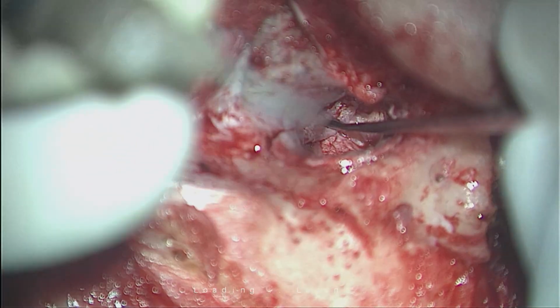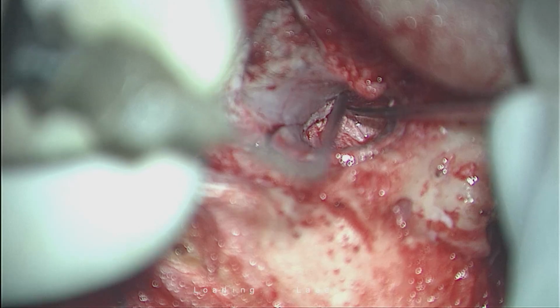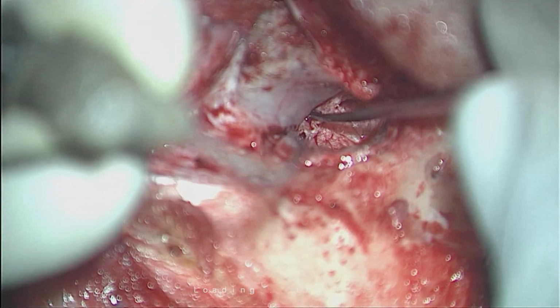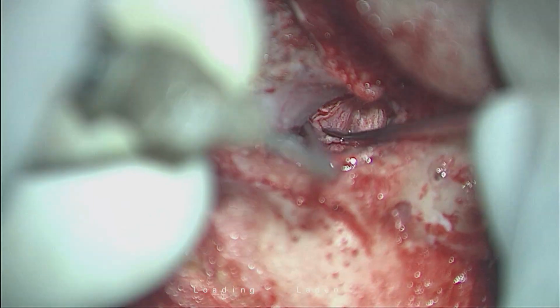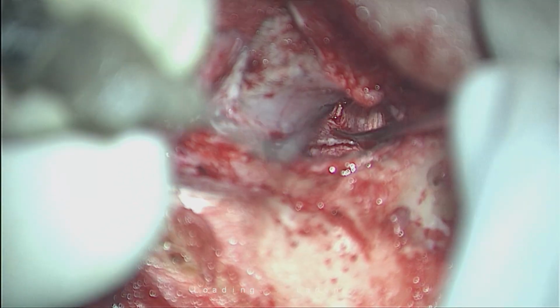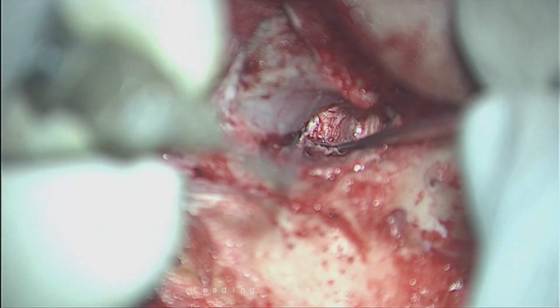Yes. Now inferiorly again to check. You have to ensure that this sandwich remains in order all the way. See inferiorly. The beauty is check, recheck, and recheck. Sometimes your dry graft doesn't allow this ability. That's why I love this fresh graft. It follows your orders.